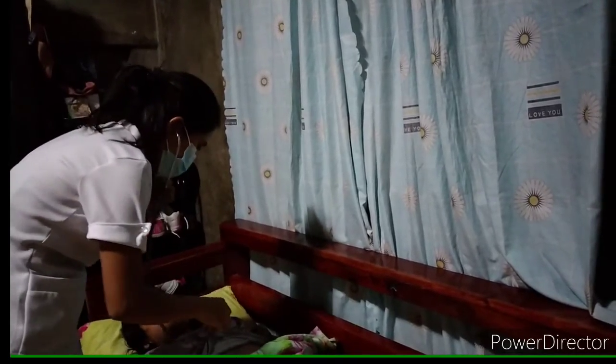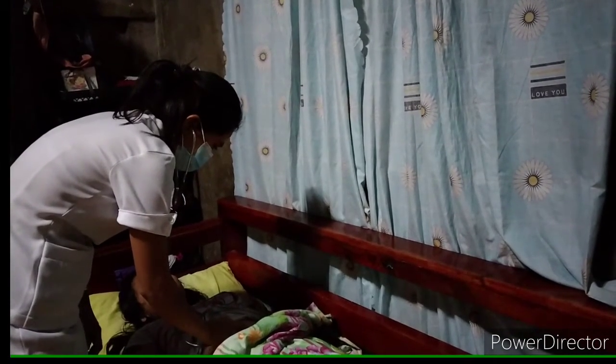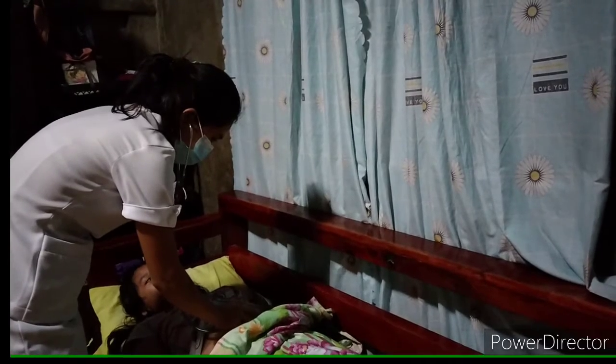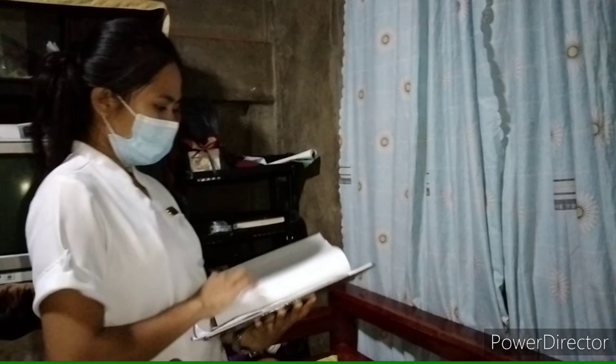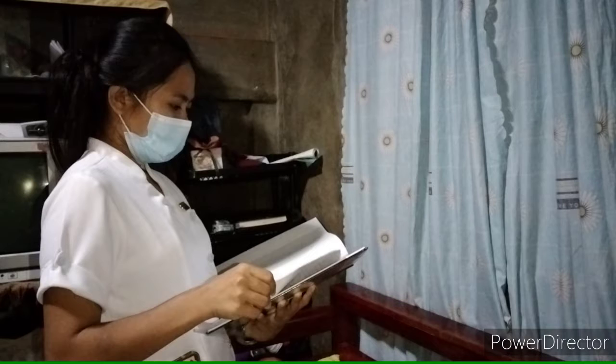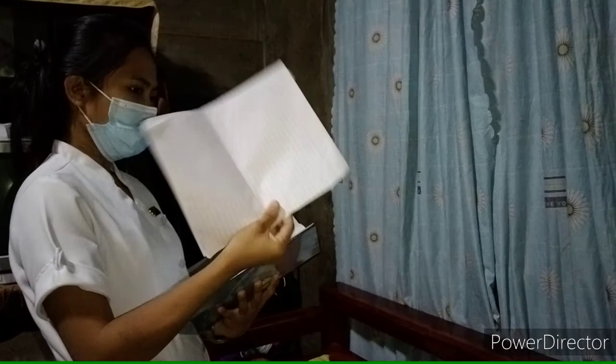Auscultate for bowel sounds before feeding. Rationale: absent bowel sounds may indicate decreased ability of the gastrointestinal tract to digest or absorb nutrients. And obtain baseline weight and laboratory values. Assess client for fluid volume excess or deficit, electrolyte abnormalities, and metabolic abnormalities such as hyperglycemia. Rationale: enteral feeding is to restore or maintain a client's nutritional status, and it provides objective data to measure effectiveness of feedings.